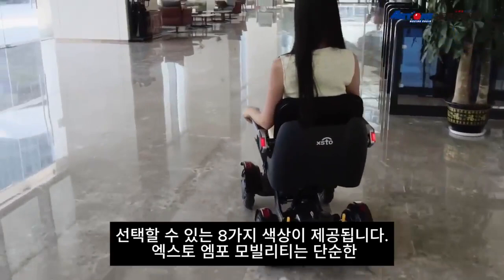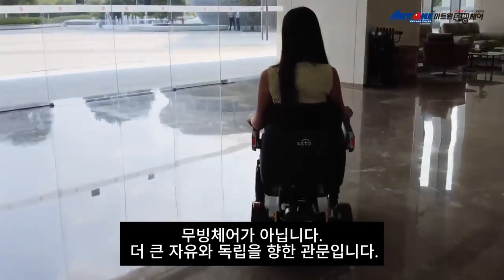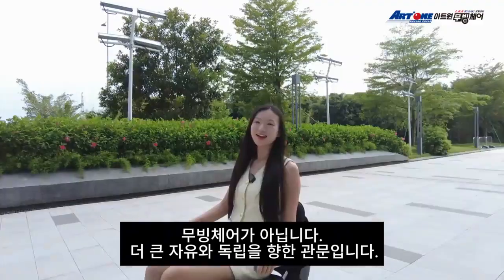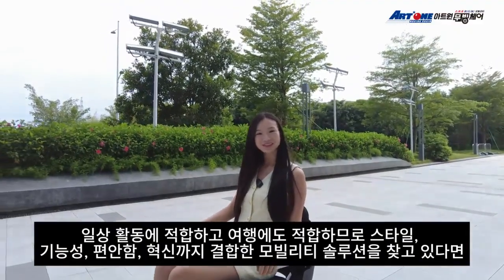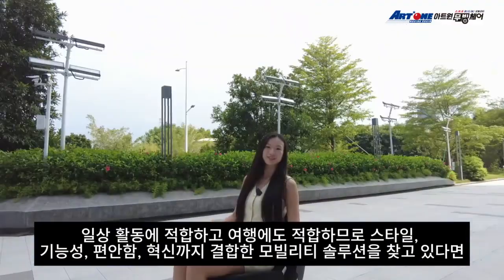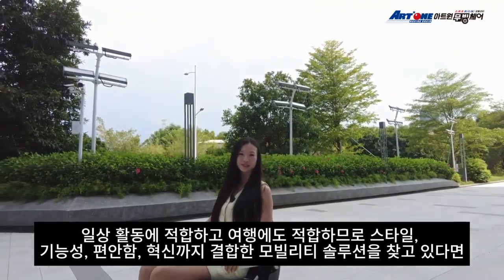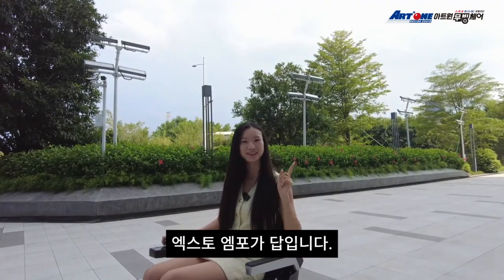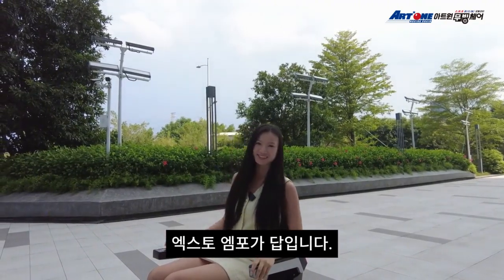XSTO M4 Mobility Robot is more than just a power wheelchair — it's a gateway to greater freedom and independence. It's perfect for daily activities and travel-friendly. If you're looking for a mobility solution that combines style, functionality, comfort, and innovation, XSTO M4 is the answer for you.